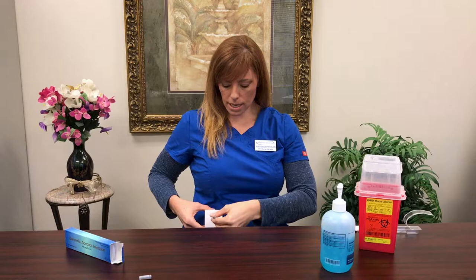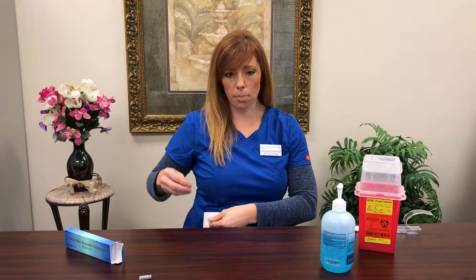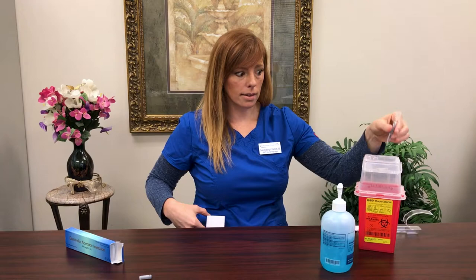I want you to go directly into your skin, pushing all of the medicine in, including the air bubble. The air bubble is going to push the medicine into the skin. Then pull out your needle and drop your Ganorelix syringe into your sharps box, and you're done.